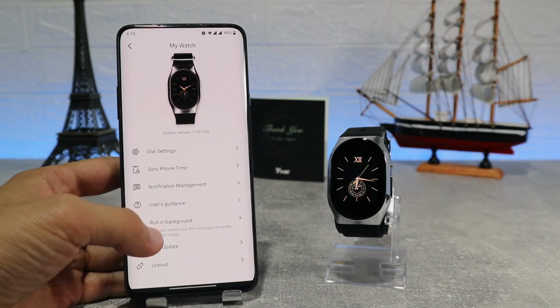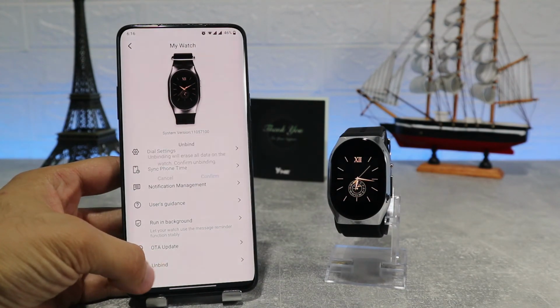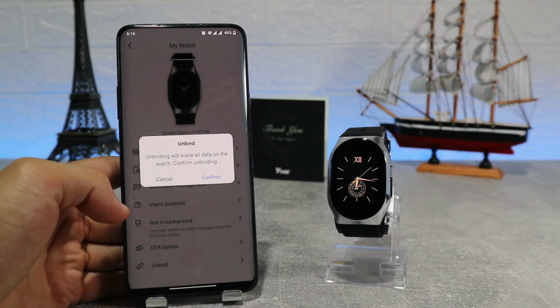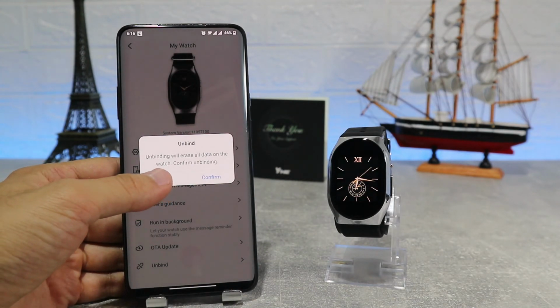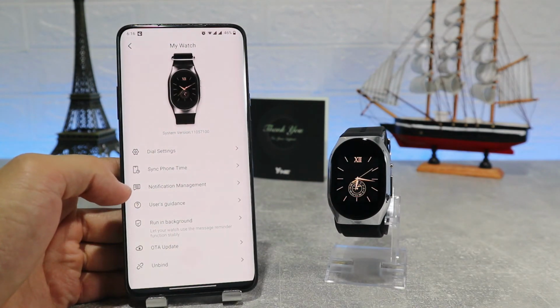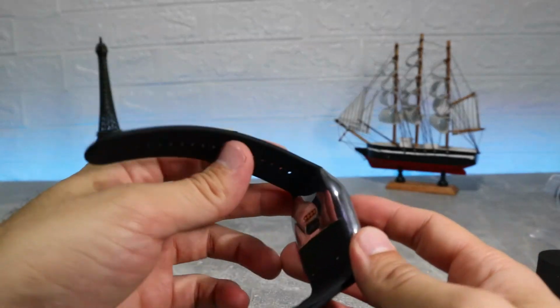Next, we have OTA update. We can check if the watch has any new firmware update. Actually, we have the latest version currently. If we want to unbind our watch from the app, we'll remove all data from our watch. We have to do this if we want to reset our device or we want to connect it to another phone. So, this is pretty much it for the watch.